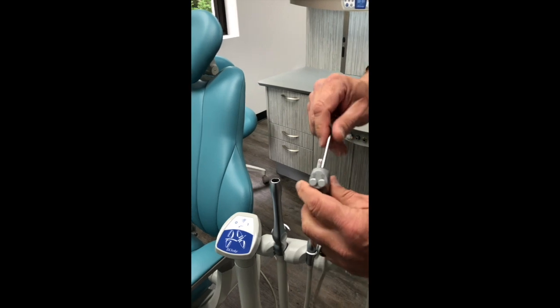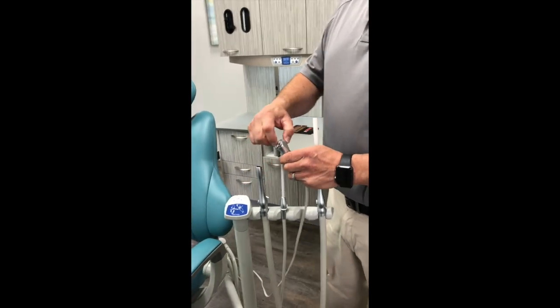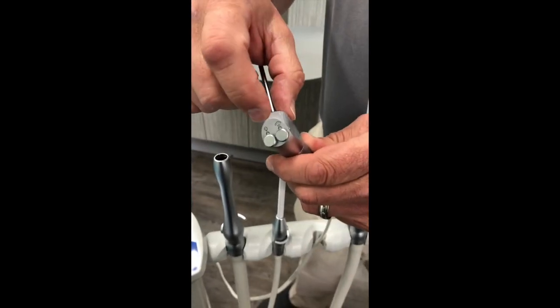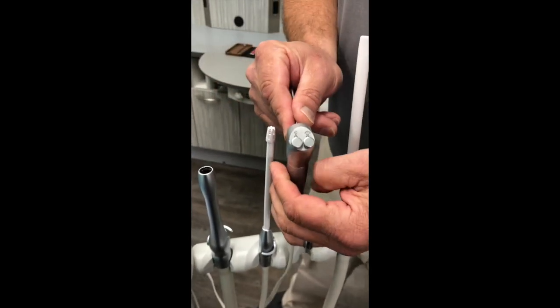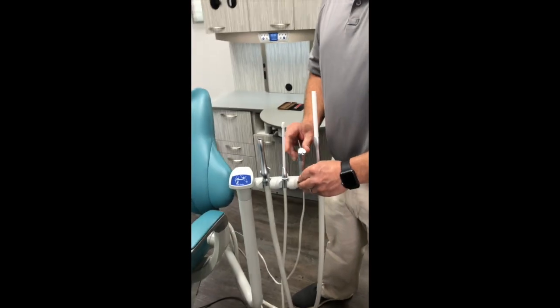If you ever have any problems with it leaking or air and water mixing, there is a kit that you can purchase to replace the buttons, springs, and washers inside. That doesn't happen very often, but after years of use you will see that possibly come up.